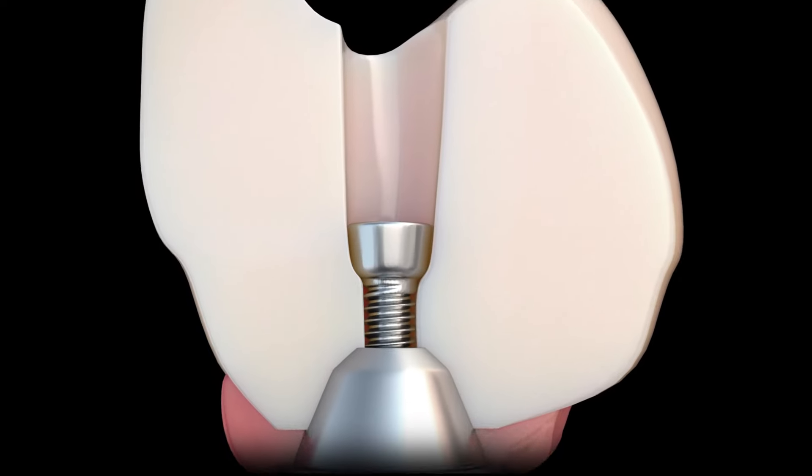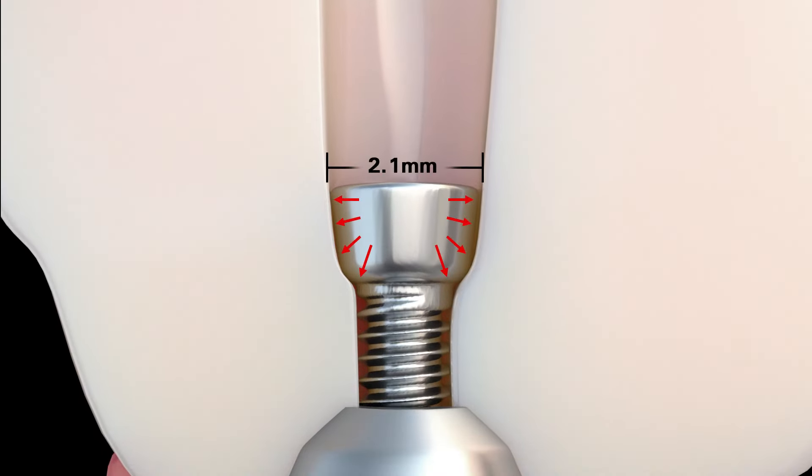What makes this screw so unique is its shape, which allows it to be held down by the lateral walls in apical direction, protecting the crown from loosening or breaking. Another feature is the increased amount of zirconia that sits under the screw head for extra stability and strength.